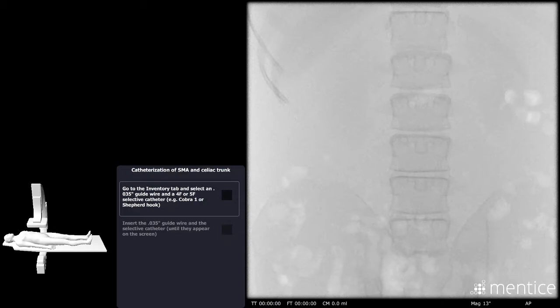And your pre-procedural planning can be very much done on, say, the liver triple phase CT. And you need to look at your arterial anatomy. You need to know, roughly, you can pick out where the celiac axis is, where the SMA would be, look at the portal vein, if you have a CT, because that will tell you if the portal vein is patent or not. You'll also be able to map out your vascular anatomy.